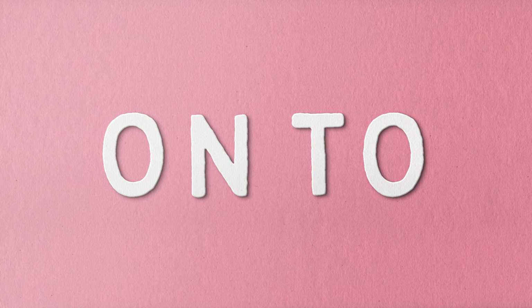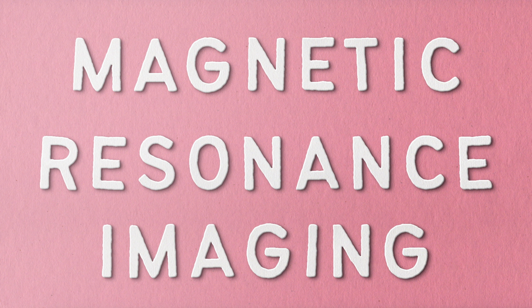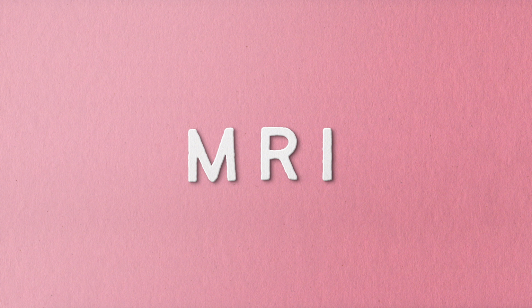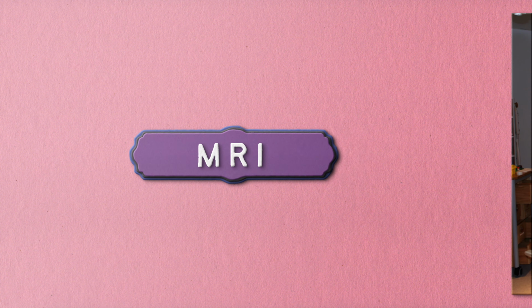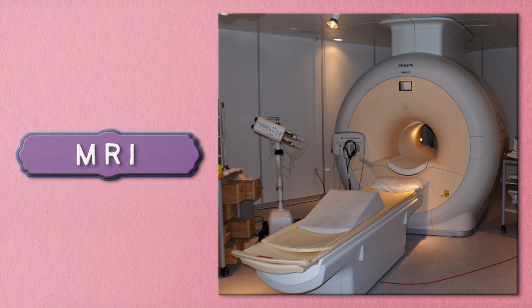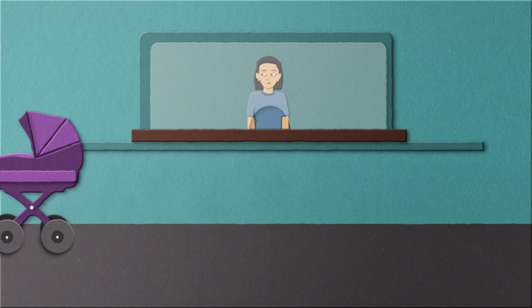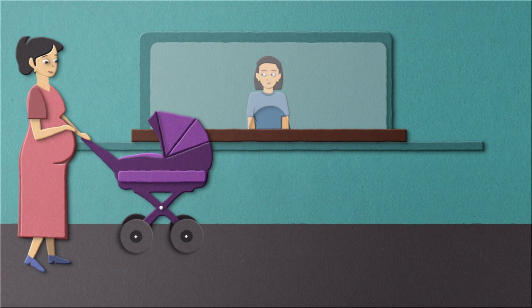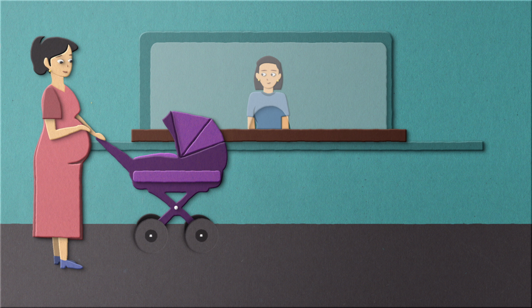We're moving on to magnetic resonance imaging, also known as MRI. Like CT scanners, MRI scanners produce cross-sectional images of your body. They provide, however, a superior quality when it comes to image detail. Another great advantage of MRI scanners is that, unlike CT scanners, they don't rely on radiation, making them safe to use on pregnant women and babies.